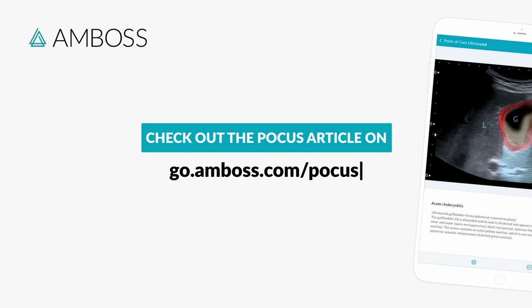Okay, now that you have an overview of the basic functions and settings of an ultrasound machine, check out the POCUS article on AMBOSS.